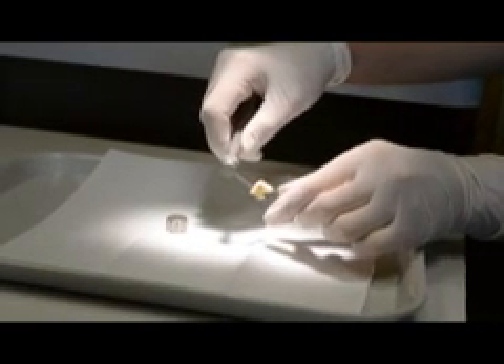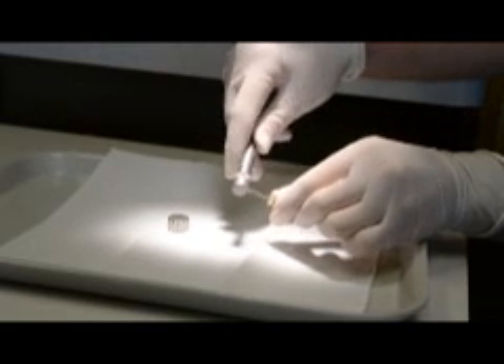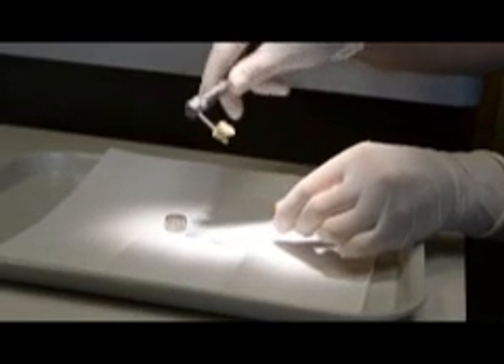Use the handle to manipulate the root tip. Try to avoid bending of the extractor — they are pretty strong but do have limitations. Use a small circular rocking motion until the root tip pulls free.